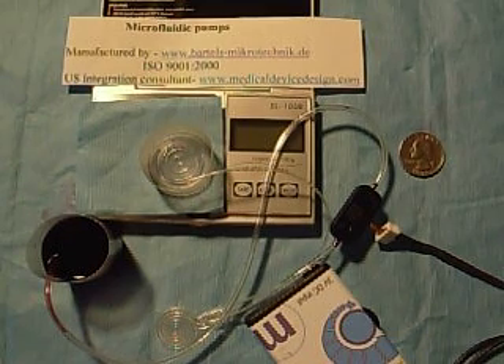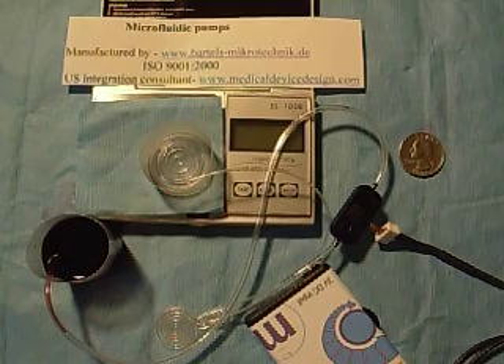Hi, it's Frank Patterson at MedicalDeviceDesign.com. Let's take a brief look at a workhorse of a micropump from Bartels Microtechnic, a leader in microsystems technology.